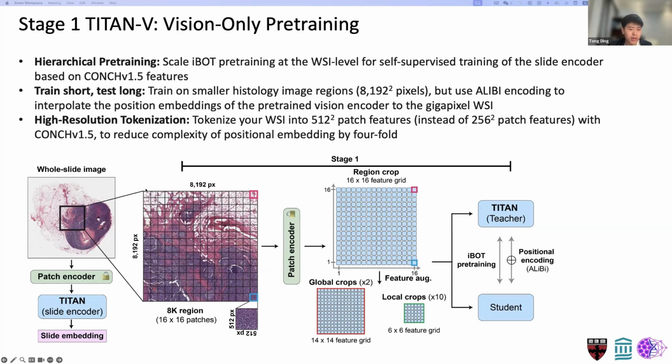In this way, with a square input of these 256 tokens into the vision transformer, we can do exactly the same training as DINO-like training methods. More specifically, here we used iBOT, which consists of two losses. The first is the student-teacher distillation loss, and the second is the masked image modeling loss, with the objective of reconstructing the tokens in this feature space.